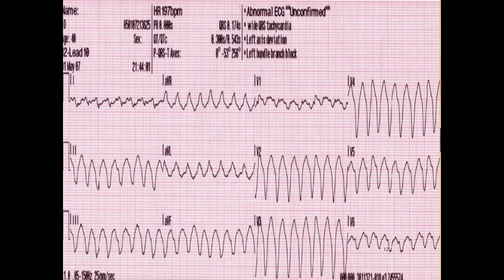She doesn't have a cardiac history. She was maybe 40 years old. No cardiac history. Younger woman. It's probably an SVT with some sort of aberrancy. Right? So what did we do? We called it into our cardiologist. Said this is probably not V-Tach. They've tried everything with her, V-Tach wise. She is stable, and we told our cardiologist we're going to hang a Cardizem drip and see how it goes. And that's what we did. We hung a Cardizem drip, and she immediately got better.